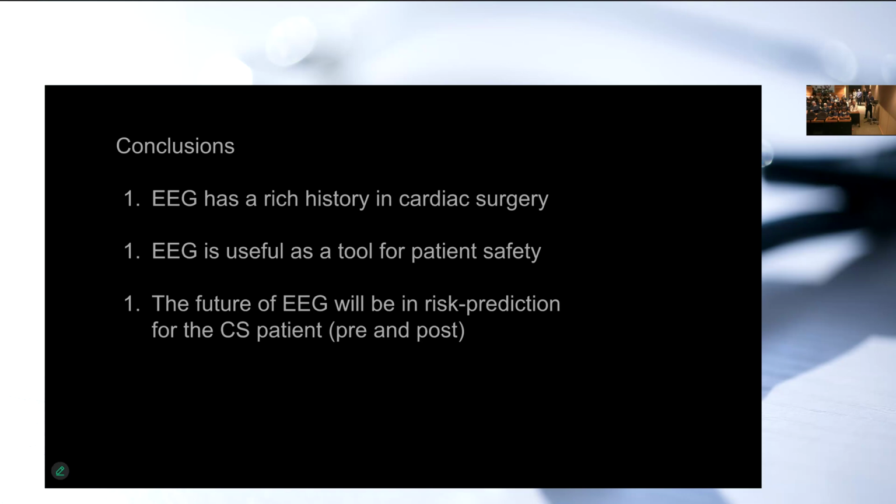Question number two is about hypothermia. Because it's not uncommon, particularly with a lot of aortic arch surgery here at the Heart Institute. And I'm often unsure what to do when the EEG changes during hypothermia in relation to both my anesthetic and analgesic management. The goal of hypothermia is to reduce cellular processing, decrease metabolic demands of the brain. But the anesthetic does some of that too, particularly with cell-to-cell signaling. So what do you do with anesthesia? Do you give more of it as you're cooling? Do you actually give less of it as you're cooling?